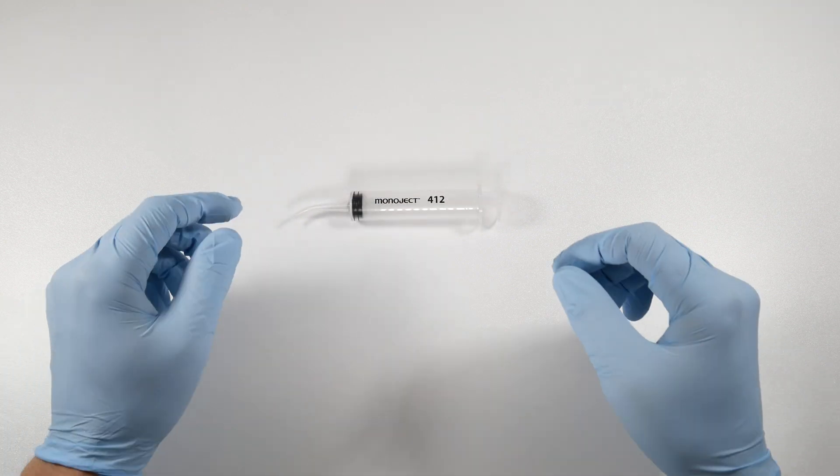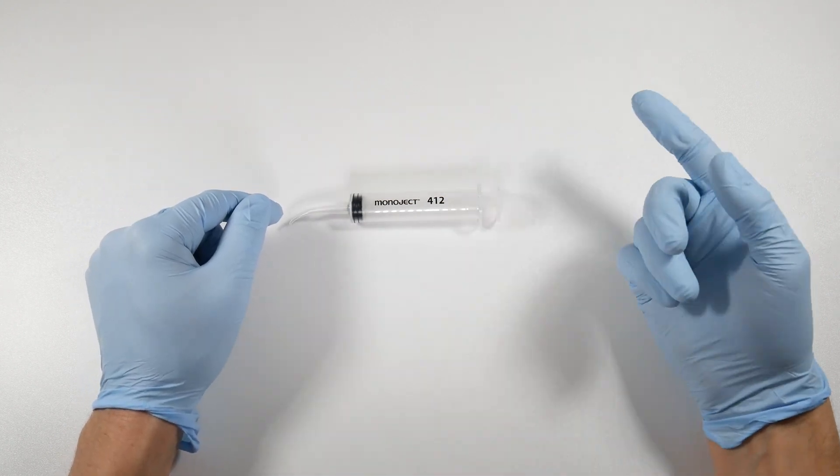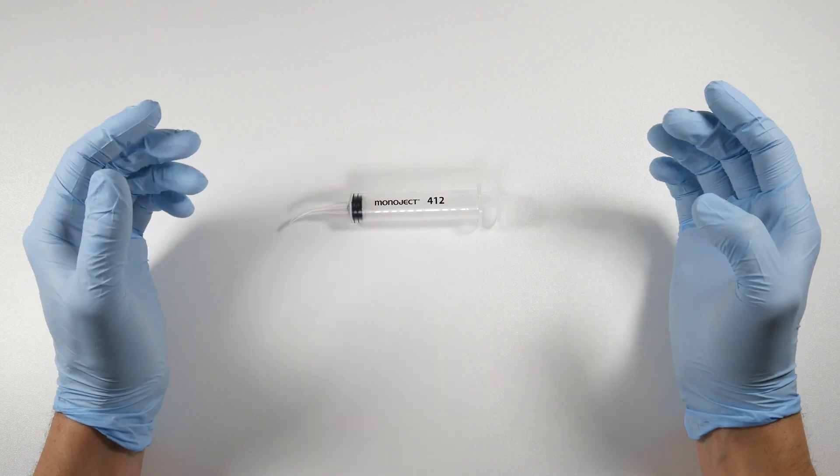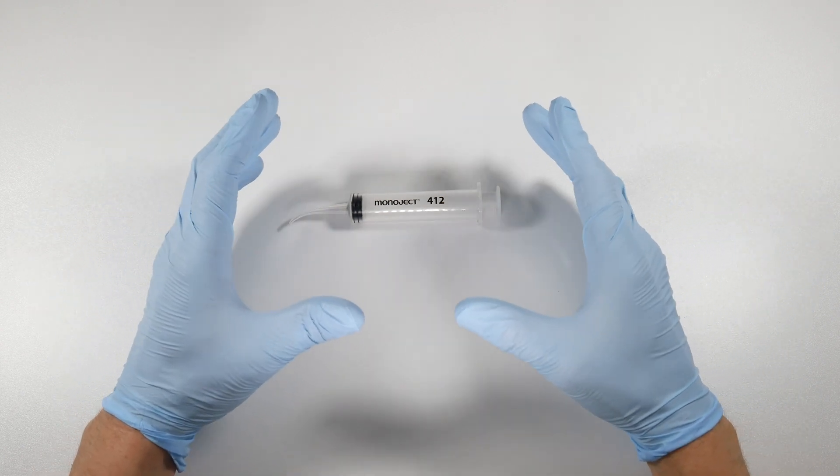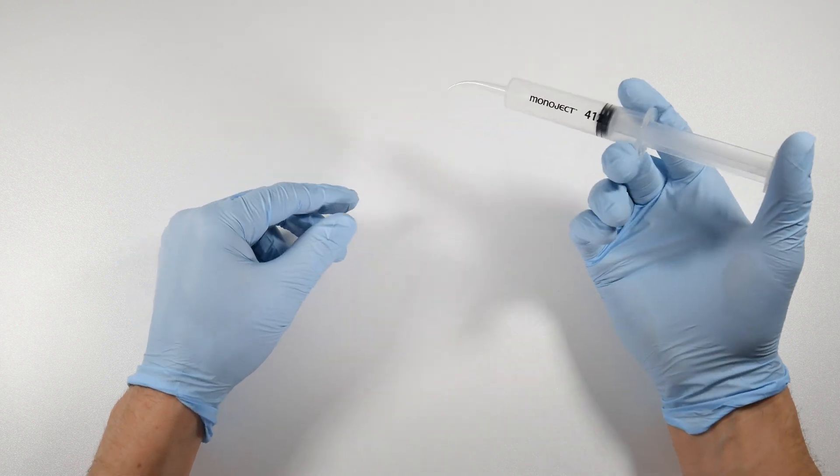When you're irrigating after an extraction, you should do it immediately. I say immediately because the more you mess around after extraction, the less time you're going to have for the bleeding to be taking place.